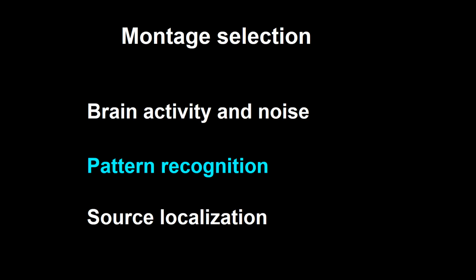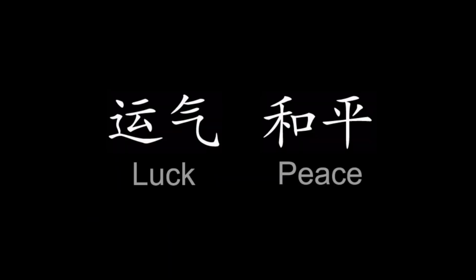In addition to recording cerebral activity with no or limited noise, that is to separate cerebral activity from noise, another concern regarding choosing the right montage is pattern recognition. Pattern recognition gives clues as to the nature of a problem. I think that interpreting Chinese symbols is the closest you can get to pattern recognition. Chinese symbols are enigmatic to non-Chinese speakers. EEG patterns are enigmatic to non-electroencephalographers, but both can be learned with effort.